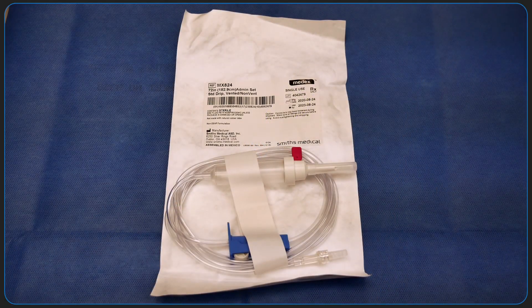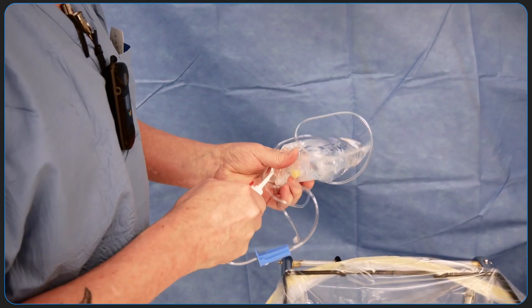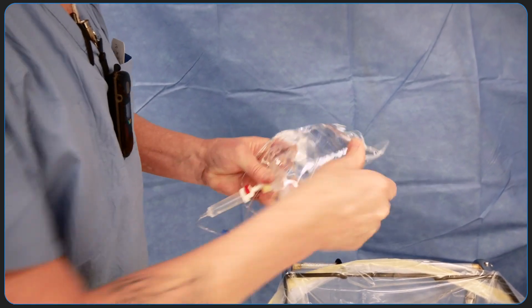Prepare an IV set by connecting to sterile water and purging all air from the line. If the IV set is closed, kinked, or disconnected, the machine will alarm with no water.